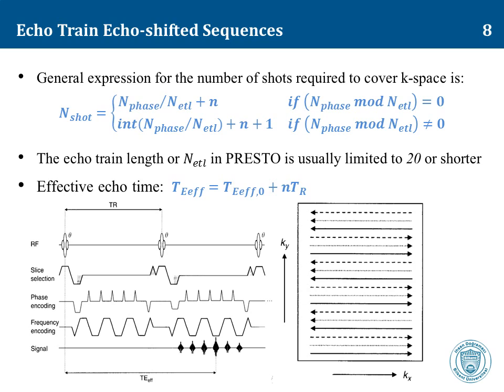The amplitude of the prephasing lobe is incremented each TR interval. A series of positive blip phase encodings are then applied in between the readout for K-space traversal in the Ky direction. At the end of the echo train, a negative rewinding lobe is applied so that the net area on the phase encoding waveform is 0 in any TR interval.